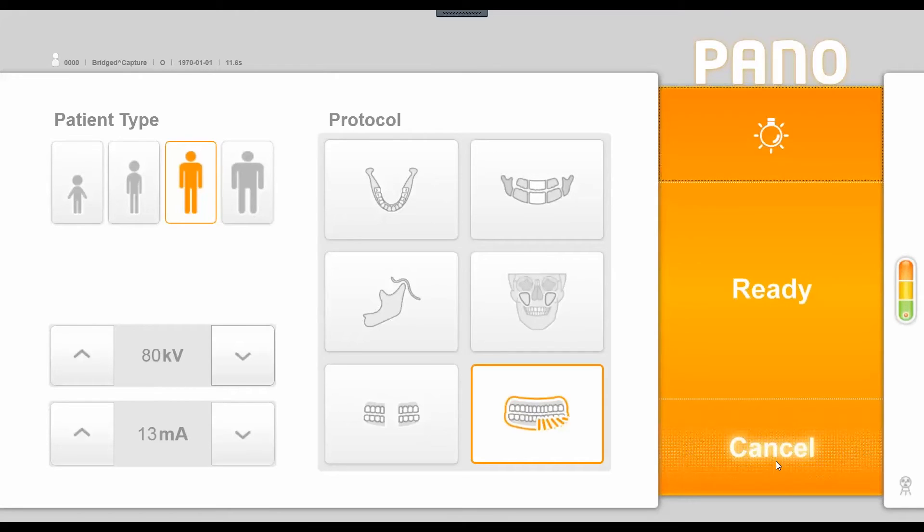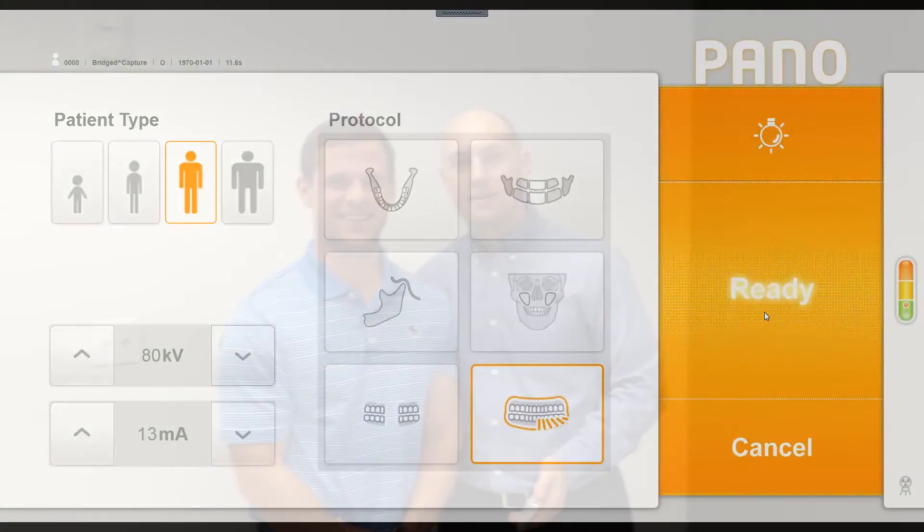Once our patient is positioned using the positioning lasers and appropriate chin rest, we click ready. The machine moves into its ready position, the LED above the X-ray generator turns from blue to green, and the X-ray exposure button also turns green. When the user presses and holds the exposure switch, the LED changes to yellow, indicating radiation is being emitted and an image is being acquired.